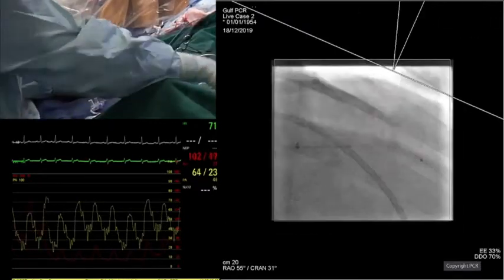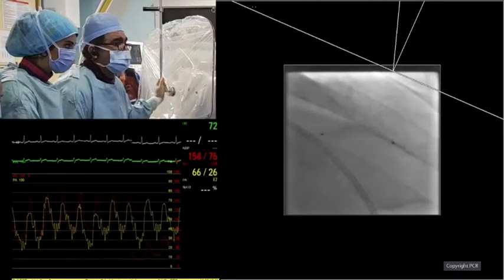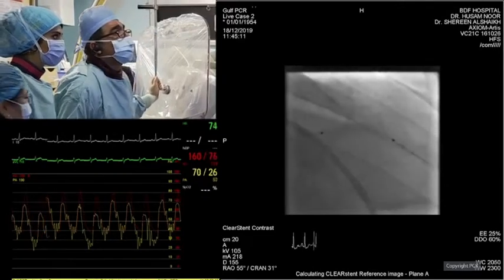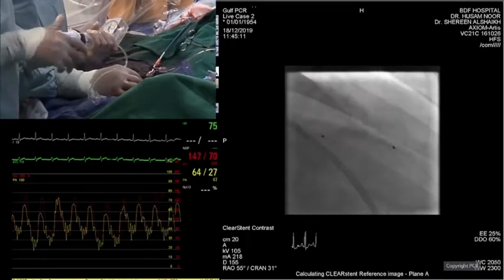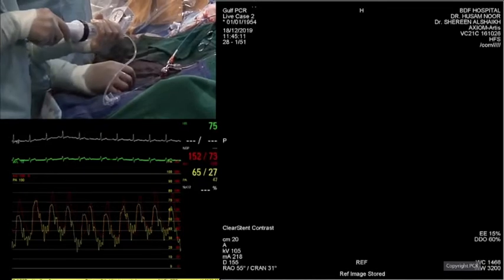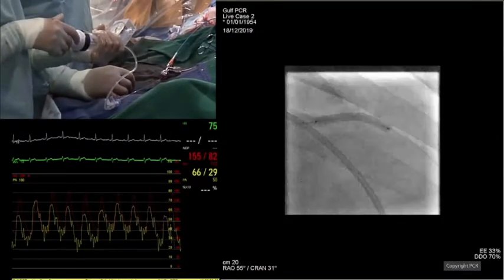And the optimization of the PCI is very important, but the safety of this patient is more important. So from the start, as we discussed before, we can fix the LAD lesion to give some flow to the circulation. We can put a femoral sheath from the start while I am doing the radial approach. We can think about the assist device.